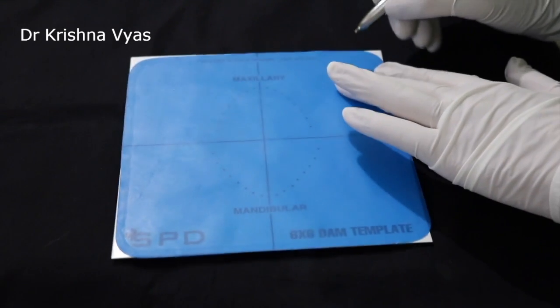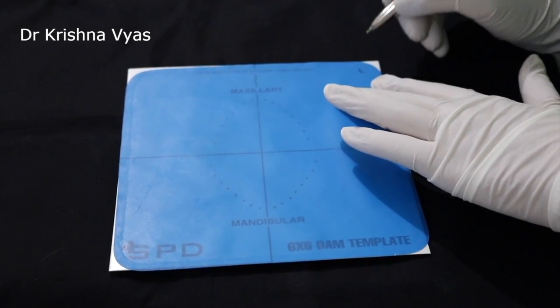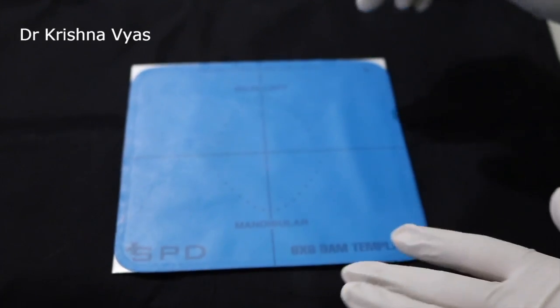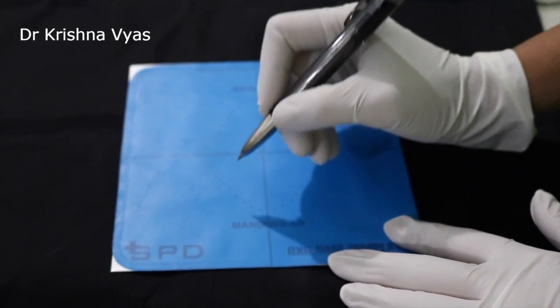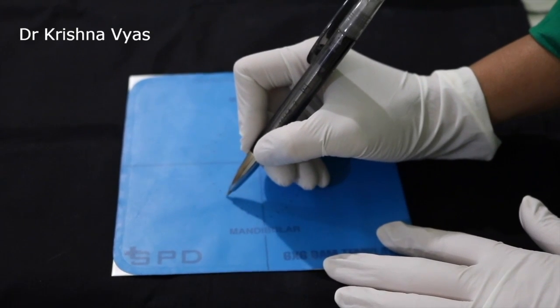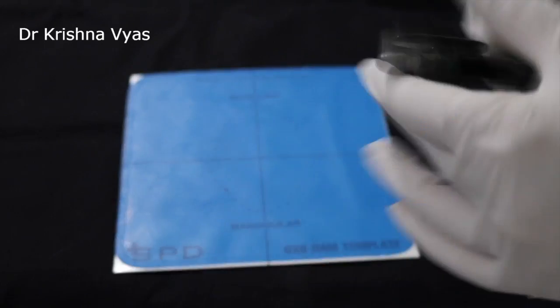Like here in this case I am marking on the left side. The tooth which I am going to work on is a premolar — so central, lateral, canine, first premolar, and second premolar. In the second premolar area I have marked a dot.